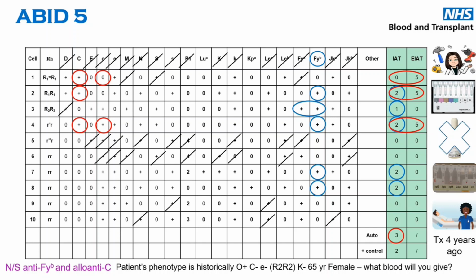So everything's sort of looking, and I have made these panels so that they're idealised, so you can see that, because a lot of panels might not have any heterozygous cells on, because if you're not going to be able to exclude them, then it's better having homozygous cells on there. Anyway, I'm rabbiting on.